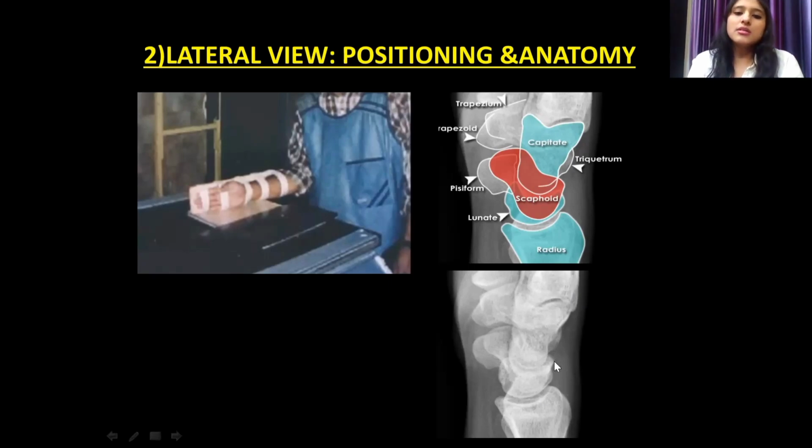Also, certain hidden fractures of the triquetrum, this shadow which is formed here, this is the triquetrum, are best assessed on a lateral radiograph. So on a lateral radiograph, if you can see, this is the shadow of the distal radius. Then this moon-shaped carpal bone is the lunate. Then this is the scaphoid bone. This is the capitate. And here is the third metacarpal base.